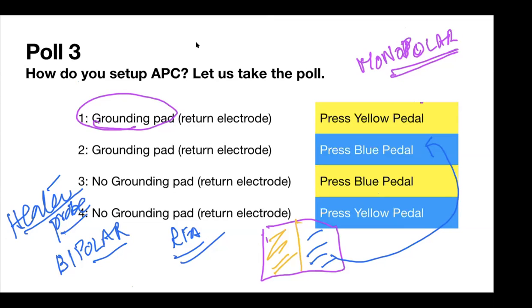You need to keep these things in mind so that when you're talking with your assistant, and you're using a heater probe for peptic ulcer bleeding, don't ask for a grounding pad because you may look a little bit stupid, to be honest with you. The same thing with the gold probe, Raju, that I was talking about. For the gold probe also, you don't need that because it is a bipolar probe. Both poles are there, and one delivers the current and then also receives the current back and returns it to the electrosurgical unit. All right. Okay, that's good.